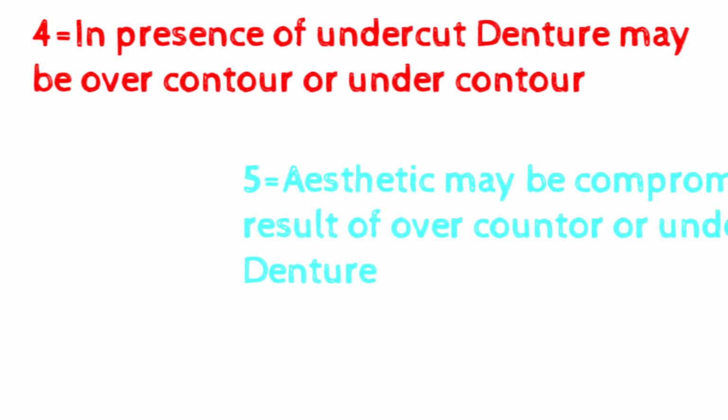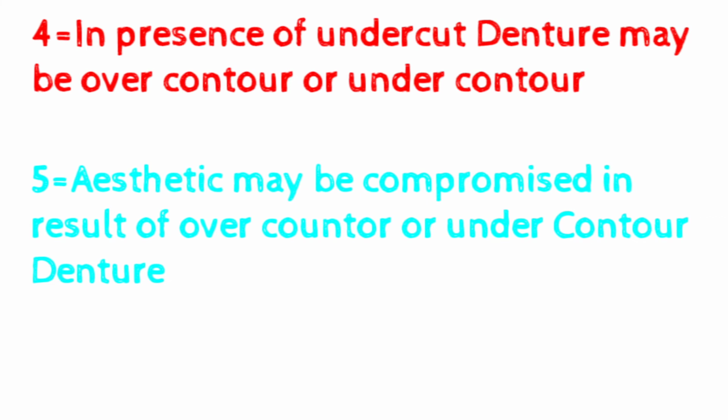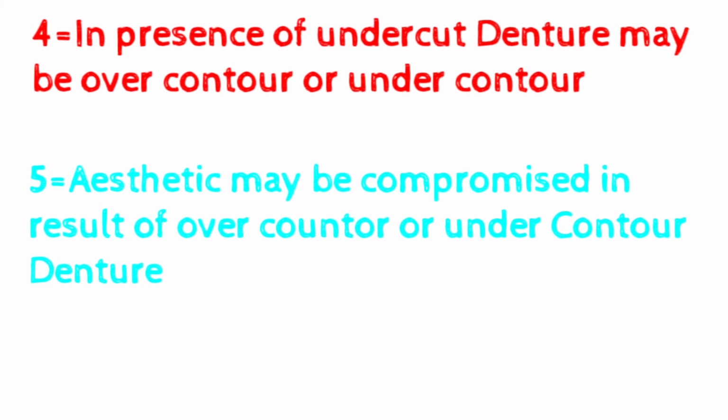And next, aesthetics may be compromised as a result of an over-contoured or under-contoured denture. If the denture is over-contoured or under-contoured, aesthetics may be affected. Now, after the disadvantages, come to the indications of overdenture.